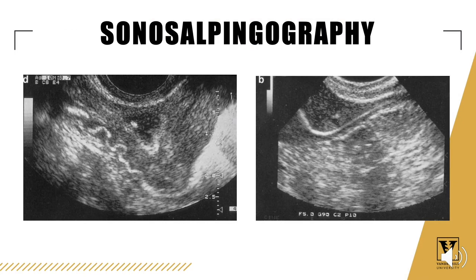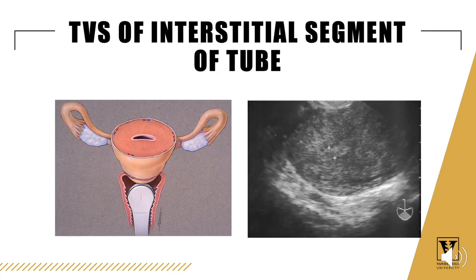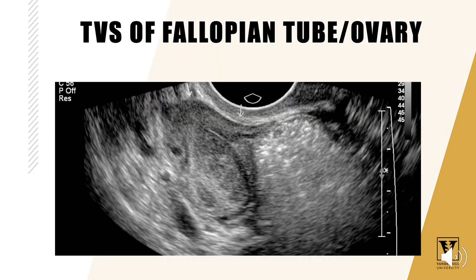These are some pictures from those studies. As you can see, the tube is very well seen using positive contrast. When we start to look at the tube, we begin to appreciate the proximal portion as it invaginates in the fundal region. The distal tube can be traced to the area around the ovary, as beautifully shown on this image. This is a recent 3D which shows both the uterus and the tube beautifully.